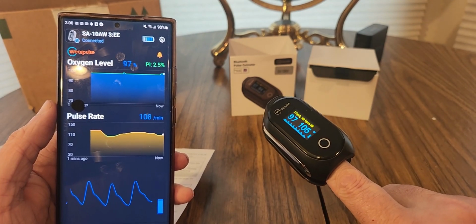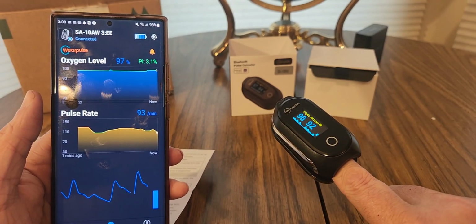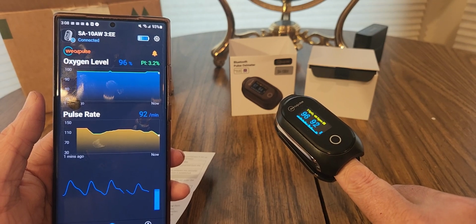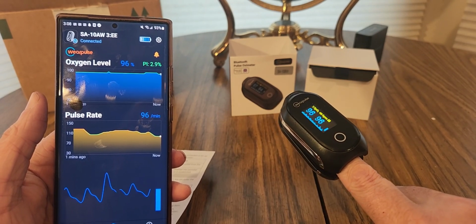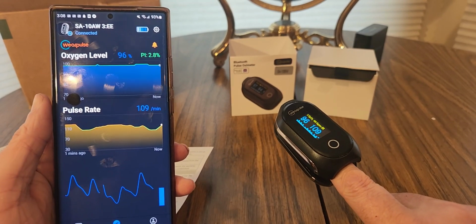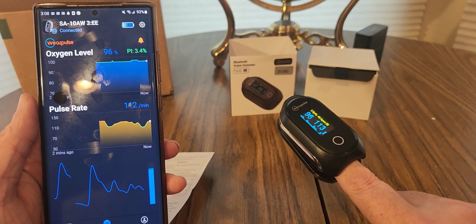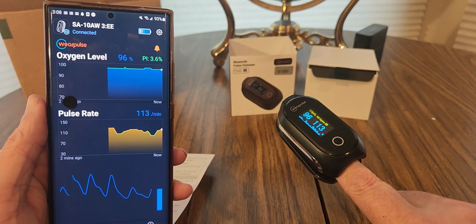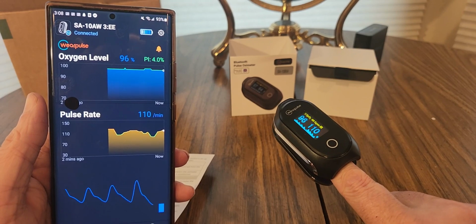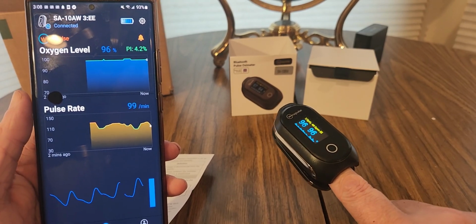So record the data onto your app. And like I said, once a week, once a month, whenever you go see your doctor, you always show them, tell them that, hey, I got this thing, and these are my results. You can always compare. Gotta love this new technology. Really cool.